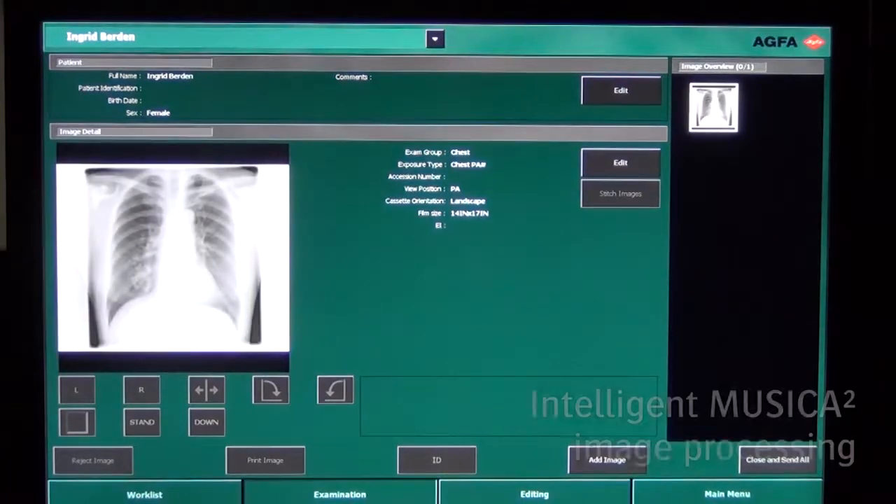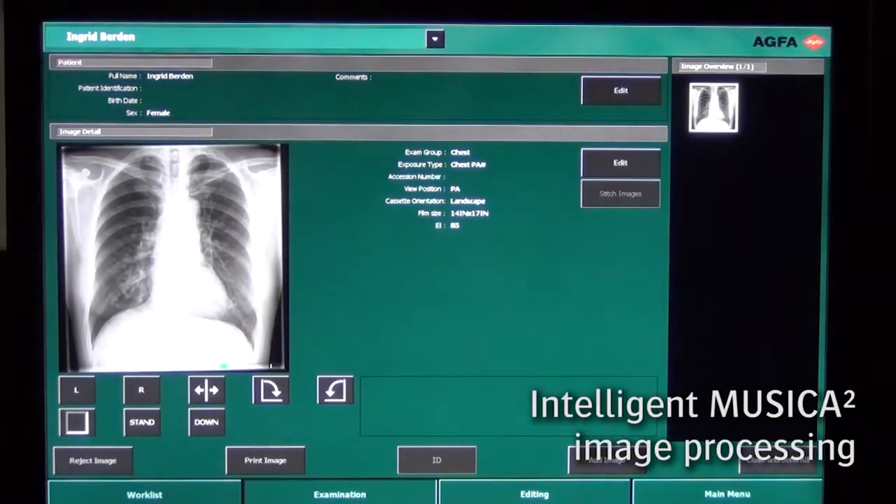Once the image is scanned, it is autocropped, Musica 2 processed, and ready for diagnosis at a central reporting department.